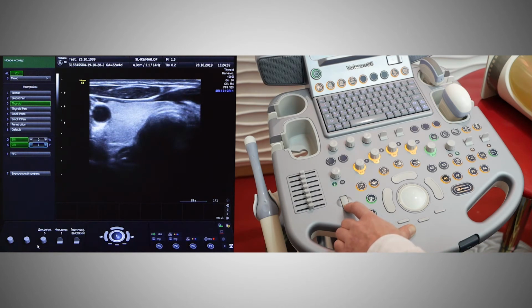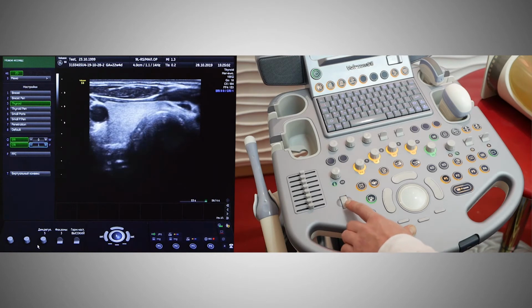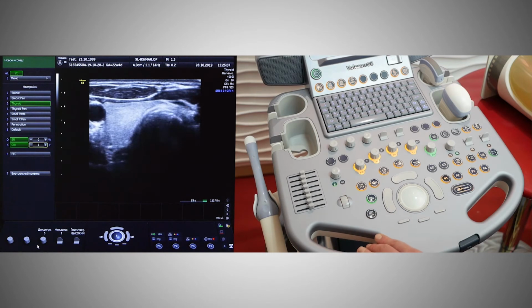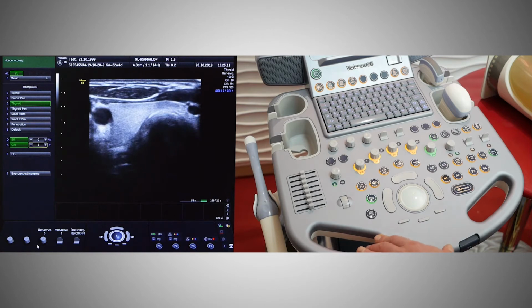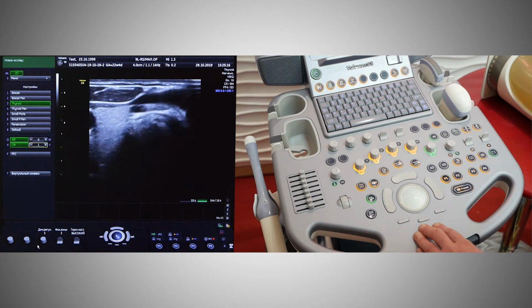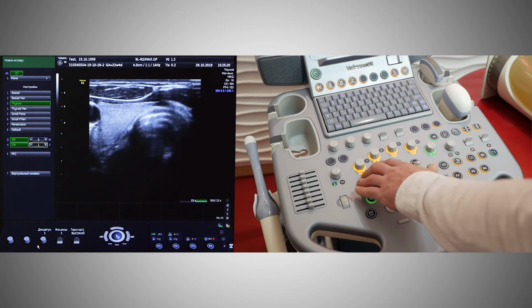And we are changing the scale. We see how the image is changing. And again, this allows you to adjust an image so that the diagnostic medical sonographer can see an image that is familiar to him. In terms of functionality, we can see on the taskbar.